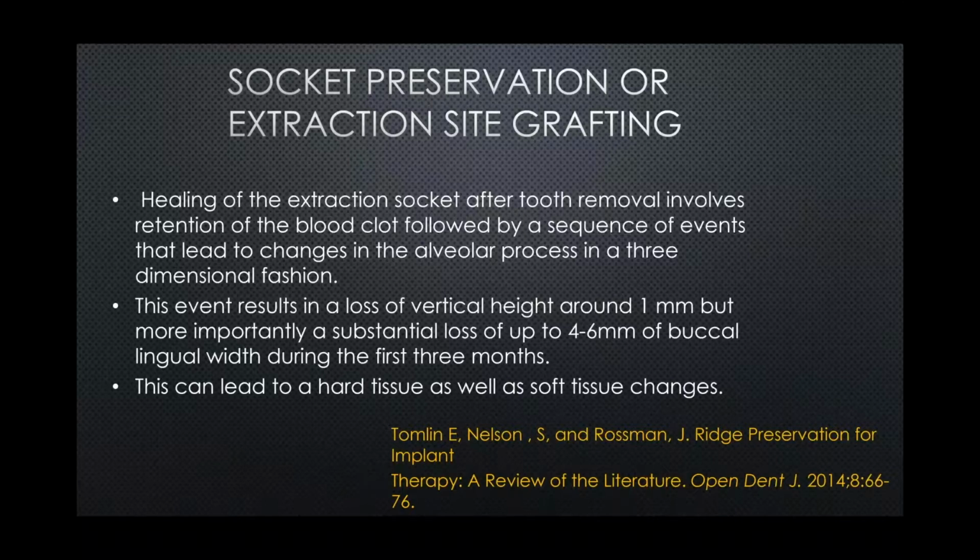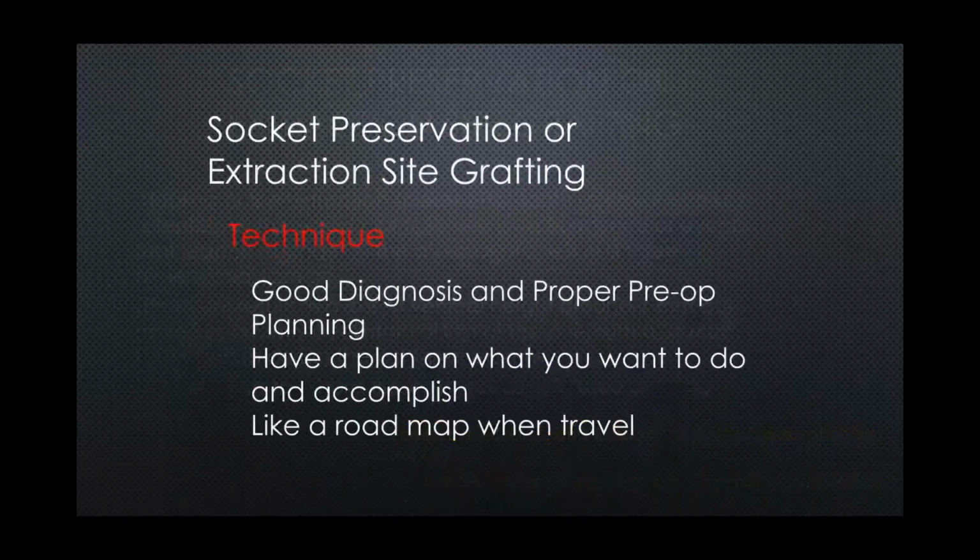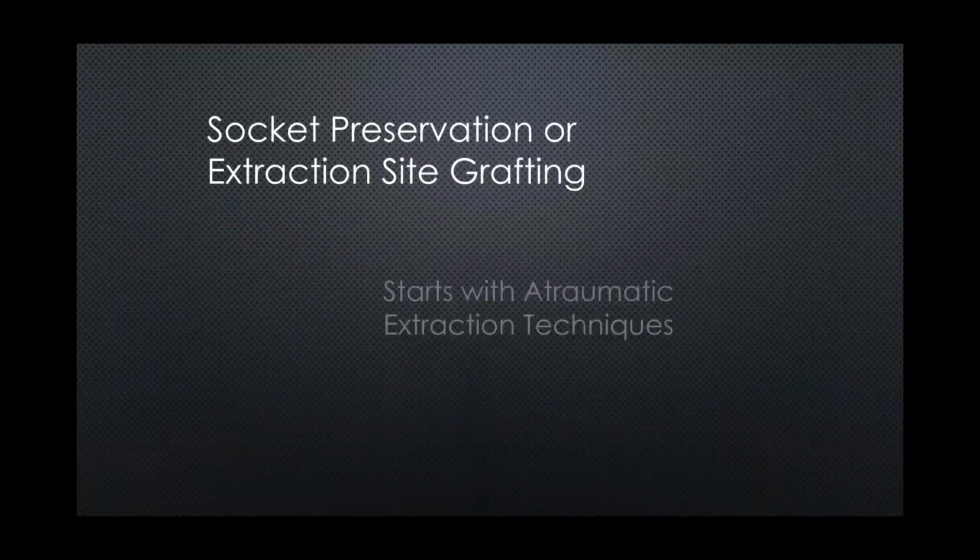But there's some indications when we graft and when we don't. We'll cover those in a few seconds. Okay, so once again, we already went through the basics of good socket preservation. Good socket grafting is extraction technique. You want good diagnosis, proper pre-planning, have a plan in which we want to do, and like we talked about, having a roadmap before you travel. It starts with atraumatic extraction techniques.